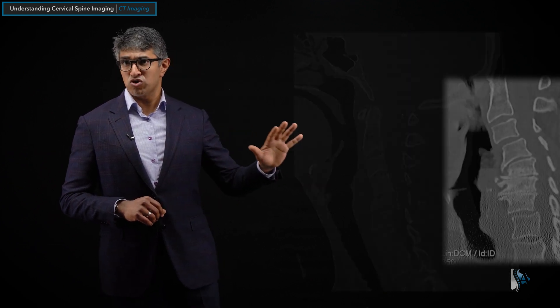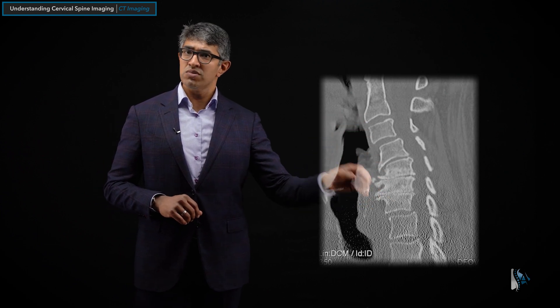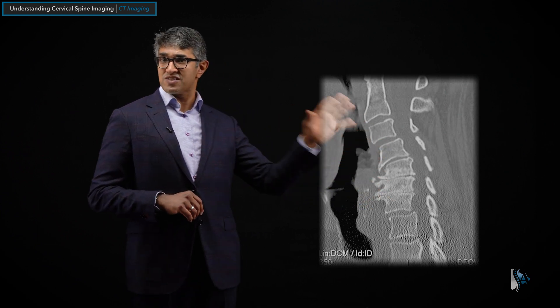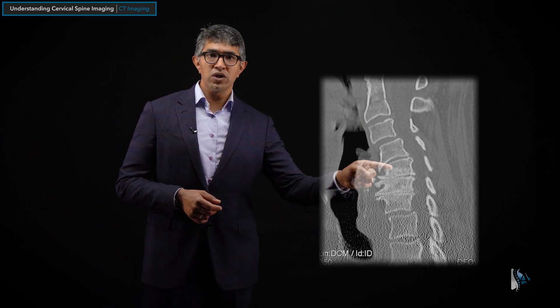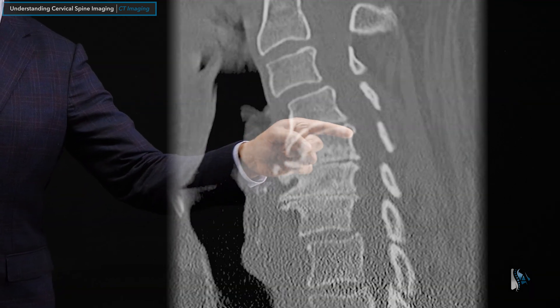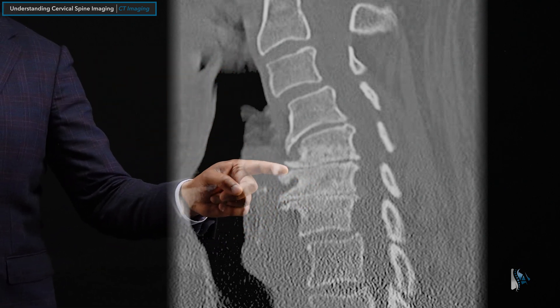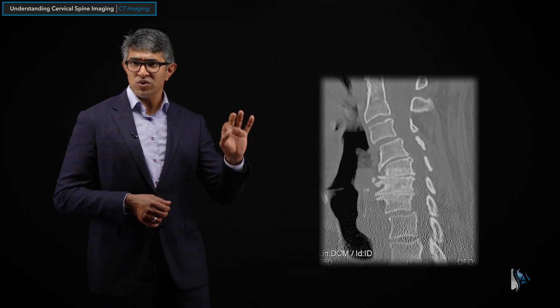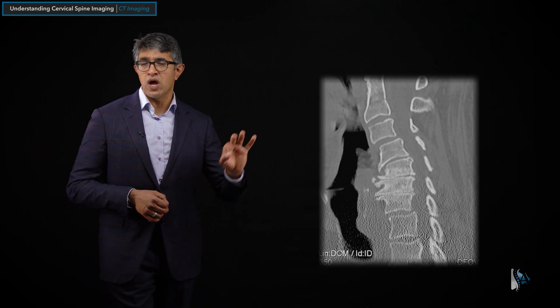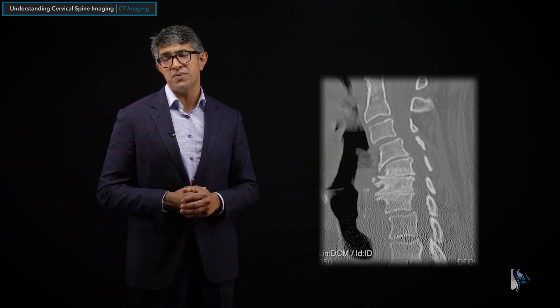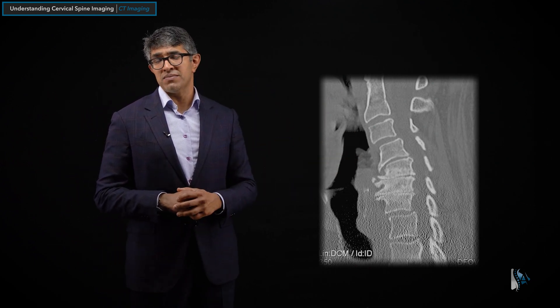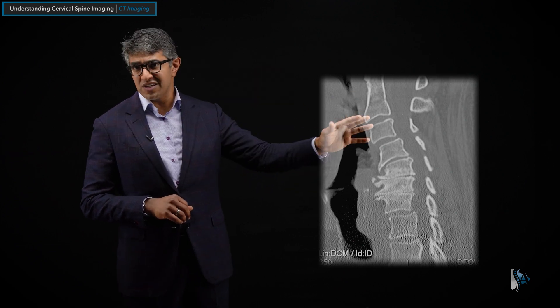Not everybody has to be traumatic. You can often find people — and this is a CAT scan through somebody with advanced degenerative disease or cervical spondylosis, like this curriculum is all about. You can see the disc is a bit worn out at the C4-5 level, and at C5-C6 there's almost no disc at all. There are some reactive osteophytes — little bone spurs in the front. CT scans are excellent for looking at the bony anatomy, though not great for soft tissue structures. But together with an MRI scan, it gives you a very complete tomographic picture of what the cervical spine looks like.